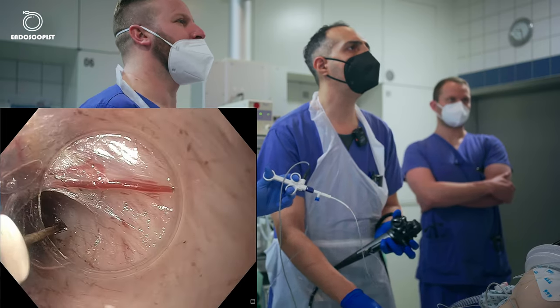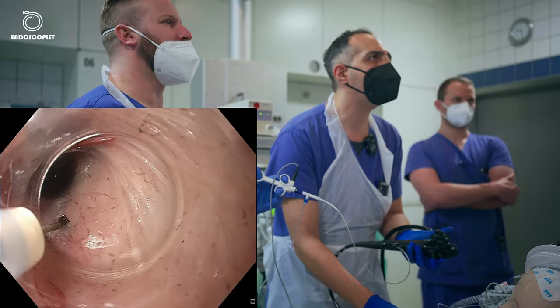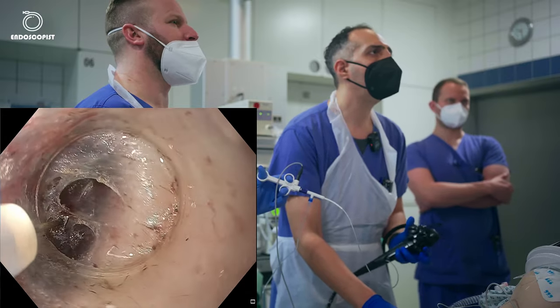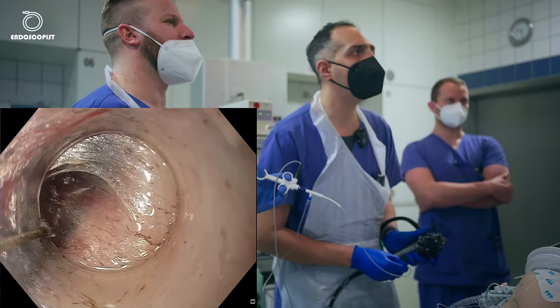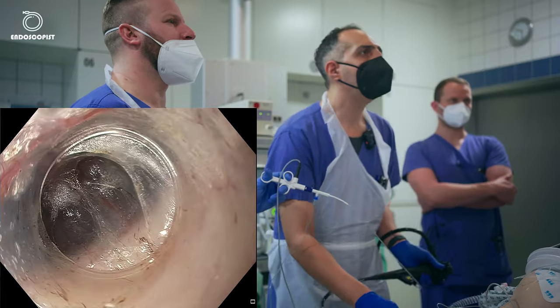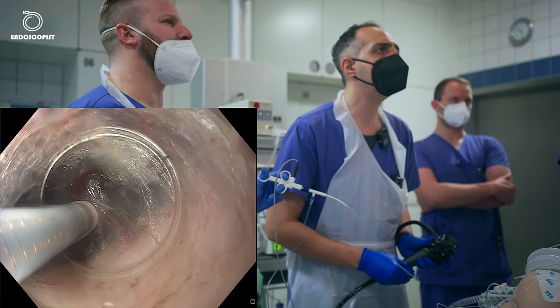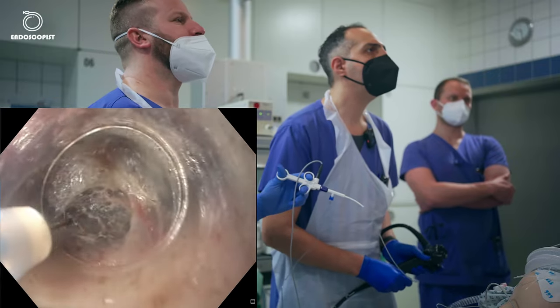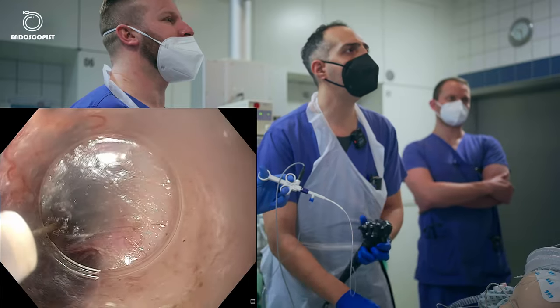You can see this vessel here, I will leave it in peace. You can cut these vessels or you can leave them. So I like to leave them if it is possible. Because of course they are there for a reason. Fine. I think we are now in the stomach. Again, I will leave this vessel in peace.